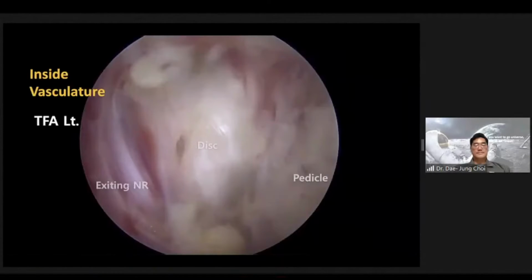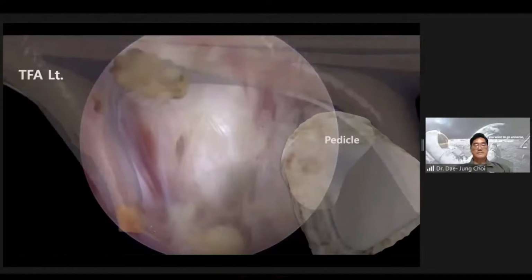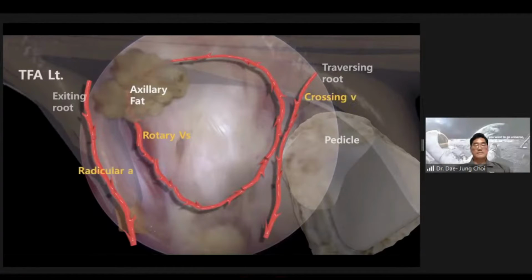The radicular artery runs into the foramen inside and makes several branches. At first, you cannot notice its direction, but when you have special eyes on it, you can come to understand its shape and control extra bleeding easily. That is a map of vascular geometry. You should keep in mind it becomes a map of the treasure island of BESS.